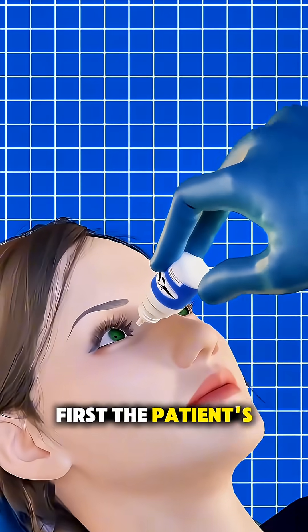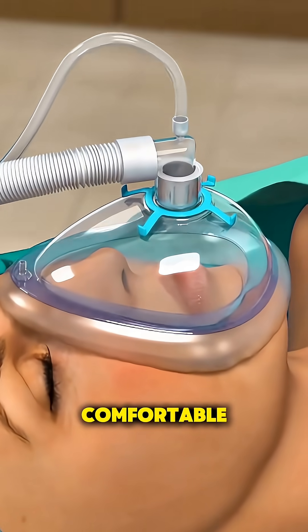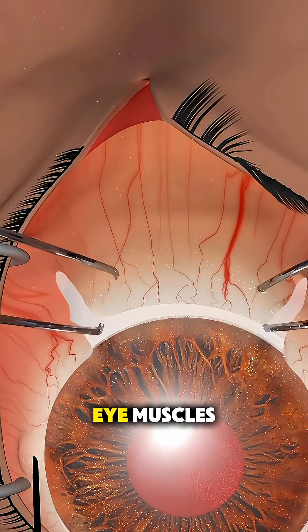First, the patient's eyes are numbed, and sometimes they're given light anesthesia so they stay comfortable. The surgeon then makes a tiny incision on the clear membrane covering the white part of the eye to reach the eye muscles.